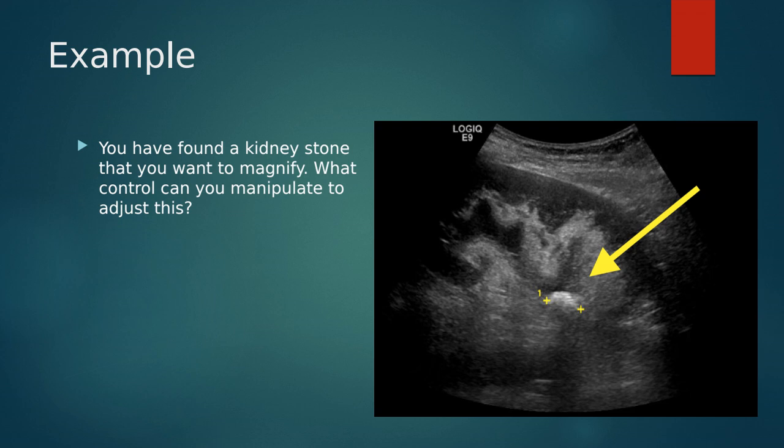I don't expect you to be able to pinpoint them precisely on the control panel as soon as you come into lab, but I do expect you to have a pretty good foundation of knowledge when it comes to how you can manipulate your picture. I don't expect you to have hand-eye coordination right away. You'll learn where those buttons are over time, but if I ask you a specific question about how to make your picture better, you'll know what control to use in that scenario.